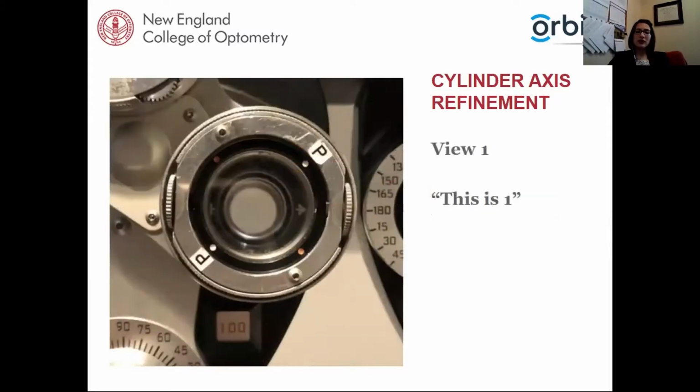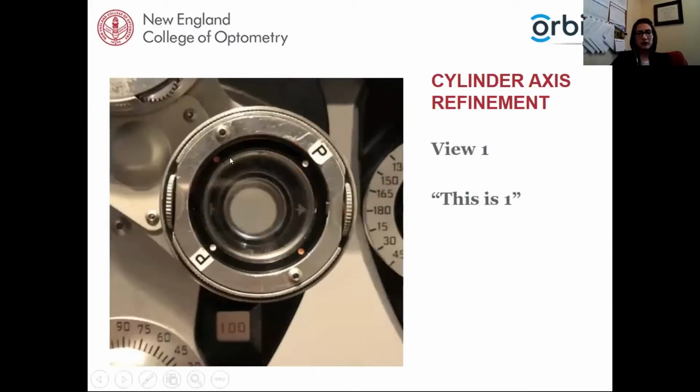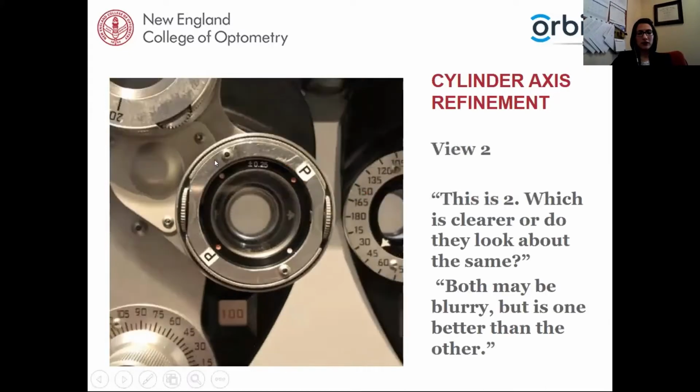So we'll tell the patient this is view 1. There's a little wheel right here, and you rotate that wheel to go from view 1 to view 2. So we say this is view 1 and this is 2. And you'll notice as we go from view 1, so we have the red dot up here, to view 2, the white dot is now up here. So the dots flip, they swap.